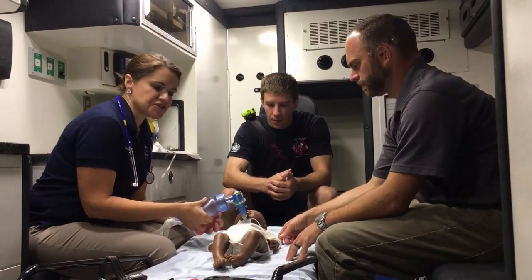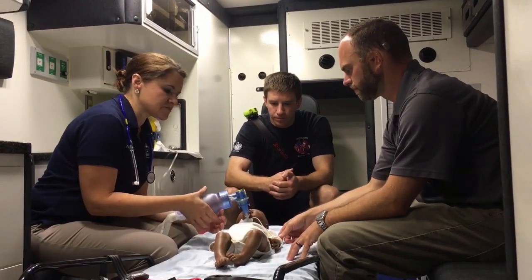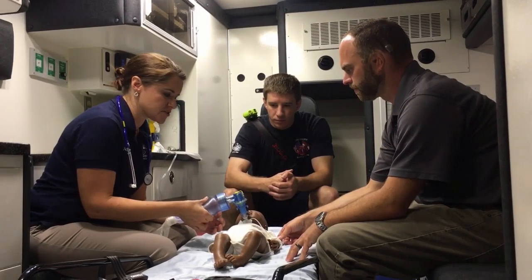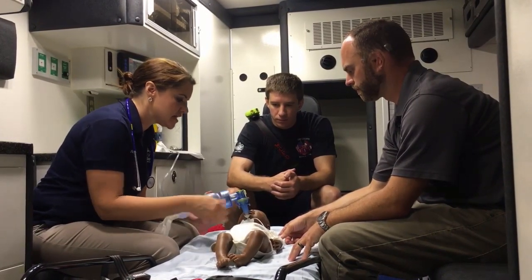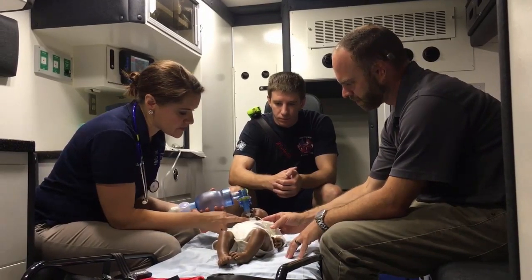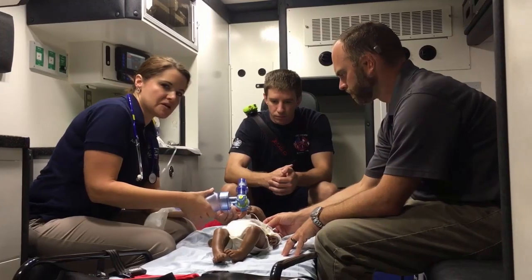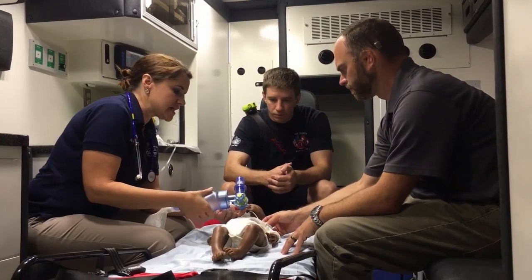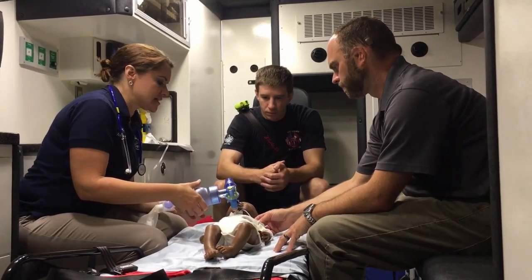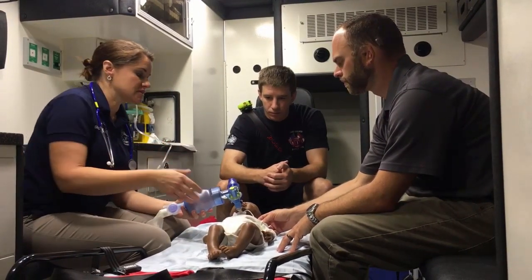We're on scene with a baby who we just popped off the vent. She was throwing high-pressure alarms, she's de-satting on us, and she doesn't look so great. We've attempted suctioning. I've assessed her trach to make sure it's in place, assessed patency, and she's becoming a little bit more difficult to bag. I'm worried she's going to start bradying on us, and I've determined it's time for an emergency trach change.